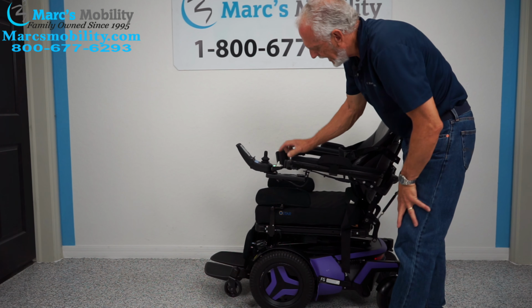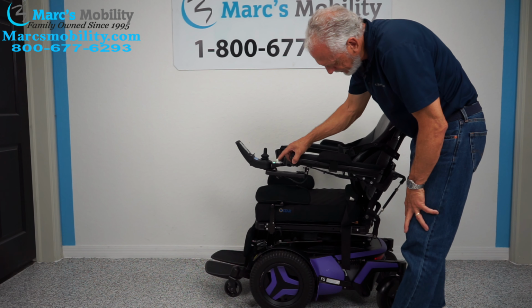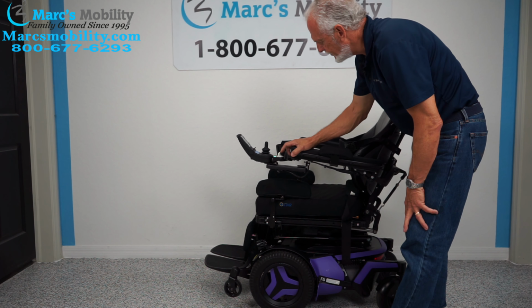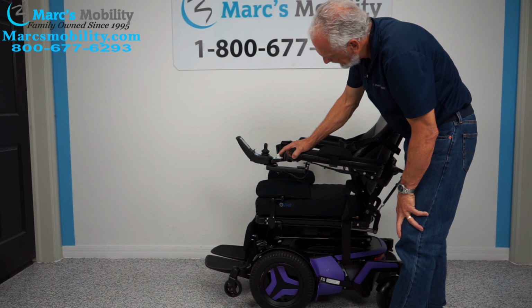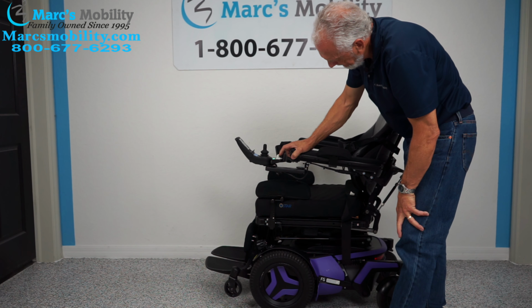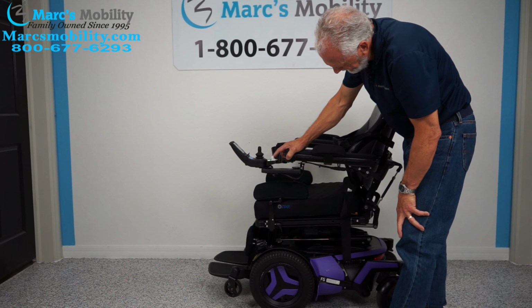position. I'm going to elevate the seat a little bit. So I'm going to raise the seat up a little bit, a couple inches. Okay? And then I'm going to do the tilt forward. Now, you got to hit it a couple times. There we go.